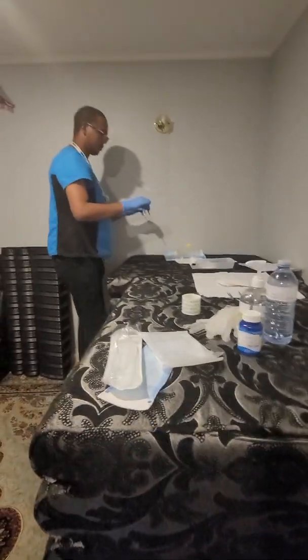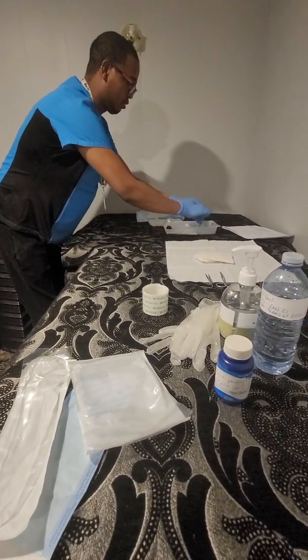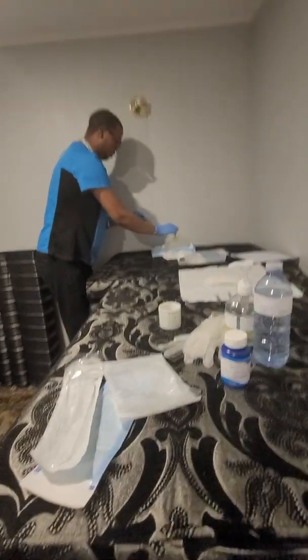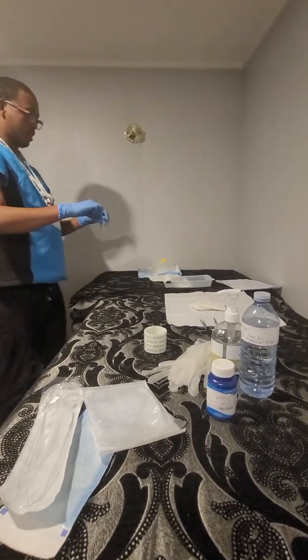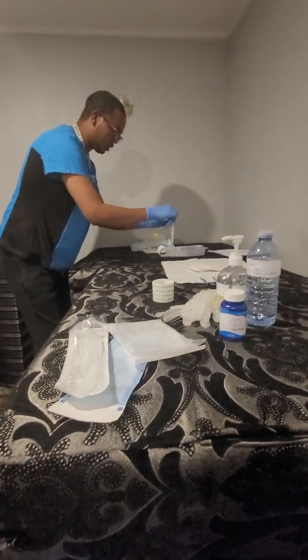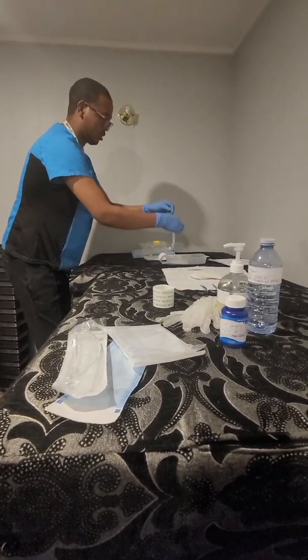Then close it. So now finally I want to just try. Toss it. Then I'm done with this one. Now I'm gonna just clean. Put this one over here.